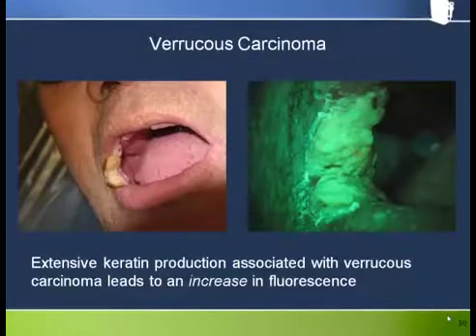Although not seen in these photographs, the VELscope might have added value to the clinical management of this lesion had it been used to examine the areas around the lesion where there was no keratin. Unexpected dark areas around the borders of lesions when viewed under fluorescence can be of help to specialists during lesion excision.